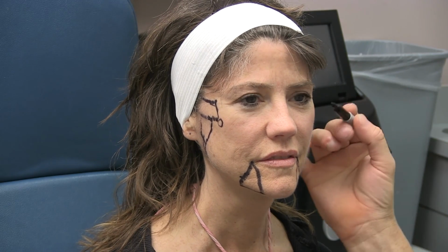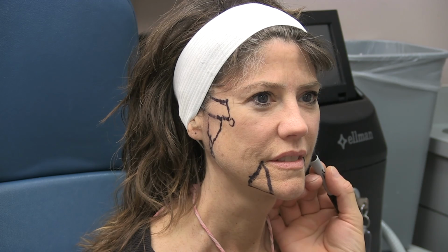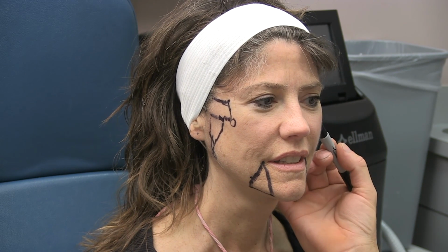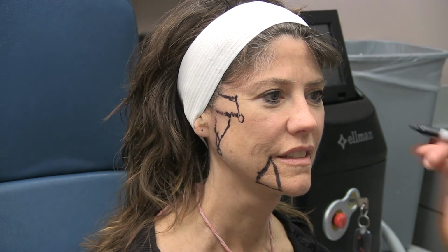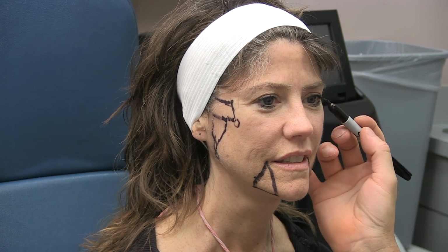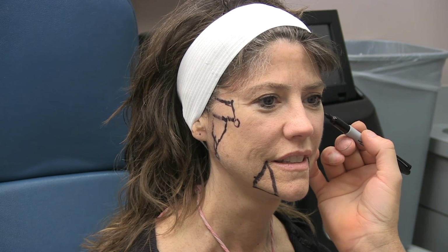and delayed bruising. Thus, first I mark the areas I have agreed to inject with the patient, and usually I plan to put in a little more on the left, as most patients have aged more on the left from driving a car, and the extra decades of daily sun damage have accumulated more on the left face. I use a Sharpie as it's easy to remove with peroxide.